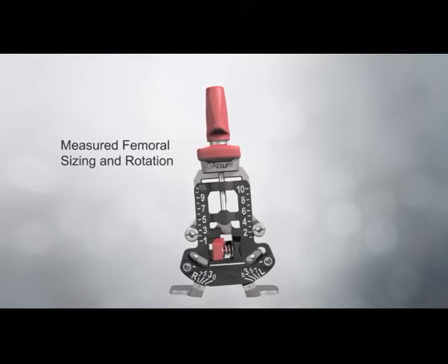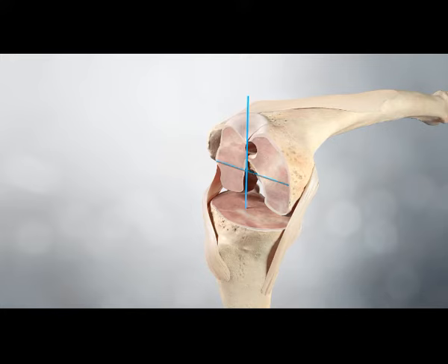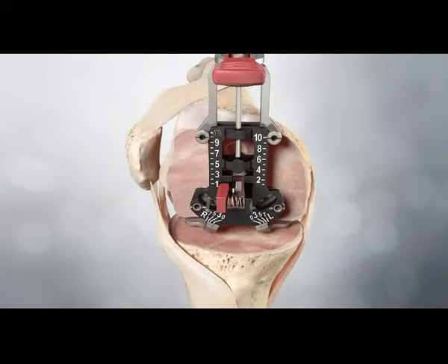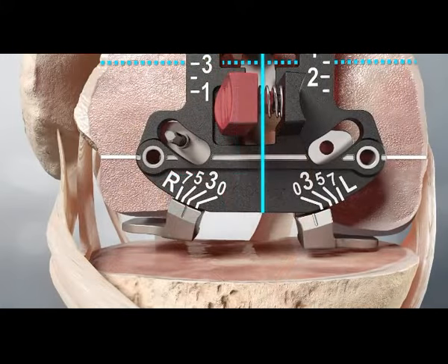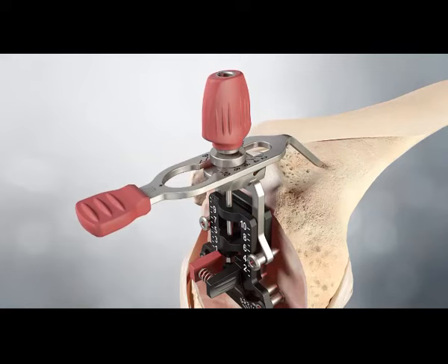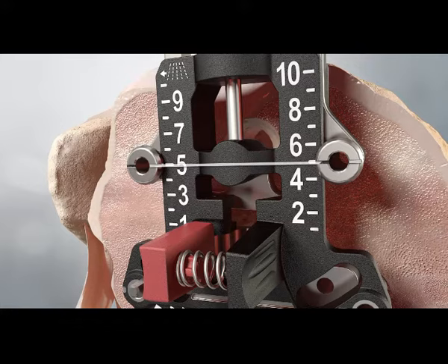Measured femoral sizing and rotation. The AP axis, Whiteside's line and/or the epicondylar axis is marked on the resected distal femur. The measured sizing and rotation guide is placed against the resected surface of the distal femur with the posterior feet of the guide contacting the posterior condyles. The guide may be provisionally secured with a pin through the fixation hole. The degree of external rotation is adjusted to be parallel to the epicondylar axis and perpendicular to Whiteside's line by squeezing the rotation lever and rotating the anterior section while holding the feet of the device against the posterior condyles. The stylus is positioned so the tip just contacts the desired point on the anterior femur. The position of the stylus will be located near the exit point of the saw blade. Adjustment of the superior inferior position of the scale indicates the proper femoral size. The line through the centre of the anterior down pinholes indicates the size of the femur.